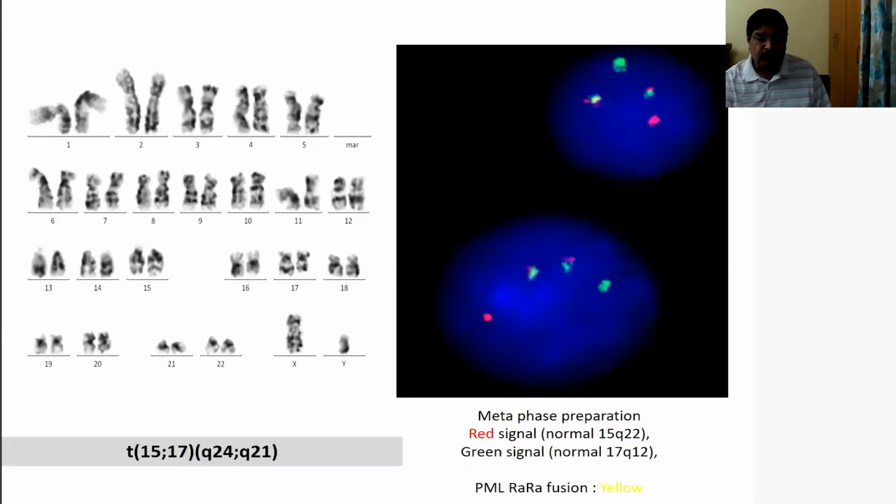So this is acute promyelocytic leukemia, as I mentioned. You have the promyelocytic morphology. Like in the last case, number 5, your TLC count was 800. Classical promyelocytic leukemias are leukopenic. They will have an abnormal count, and you will find abnormal promyelocytes. When you do a marrow and flow cytometry, you have those characteristic features. But if you do the FISH, then you will find the t(15;17) translocation. Again, you can find a fusion signal here.